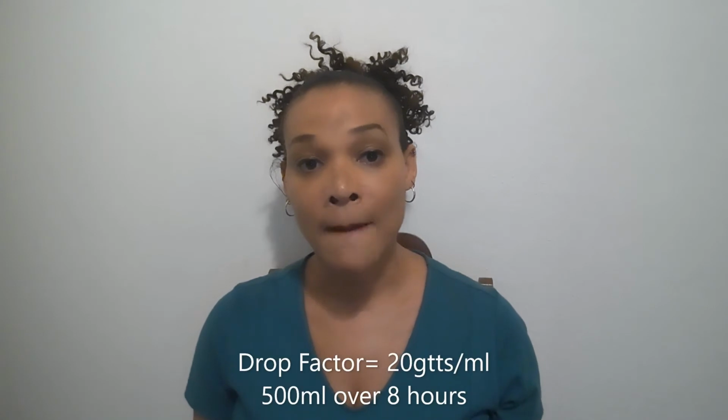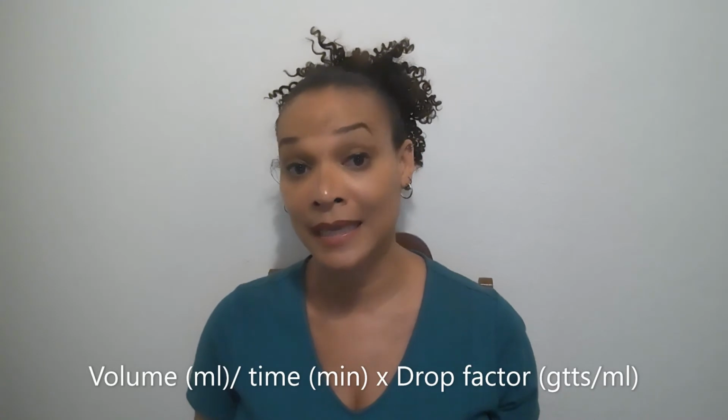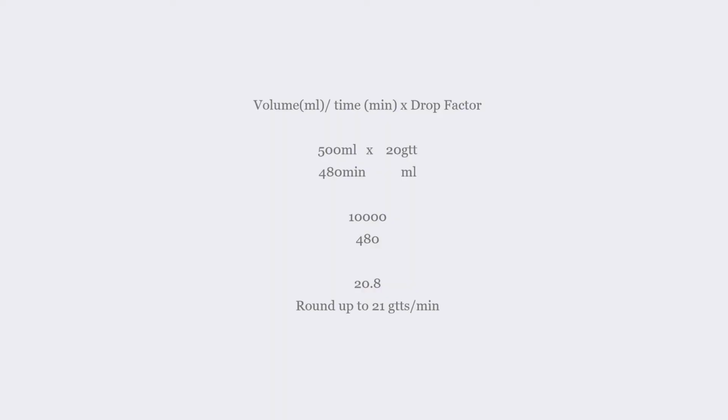If we were using a macro dropper with a drop factor of 20 drops per ml and administering 500 mLs over an 8-hour period, you would use this formula to get your drops per minute: volume in ml over time in minutes, multiplied by the drop factor, which is in drops per ml.